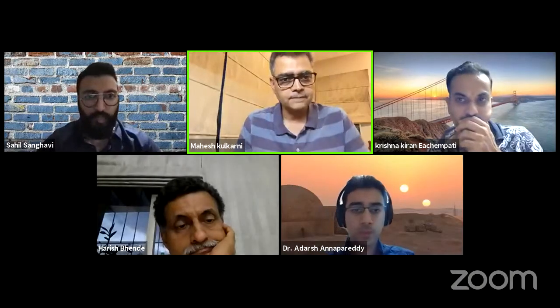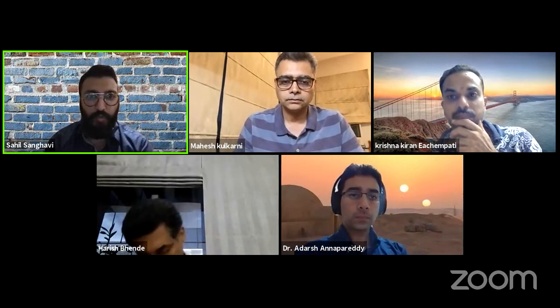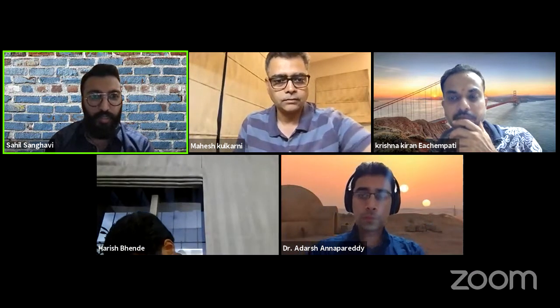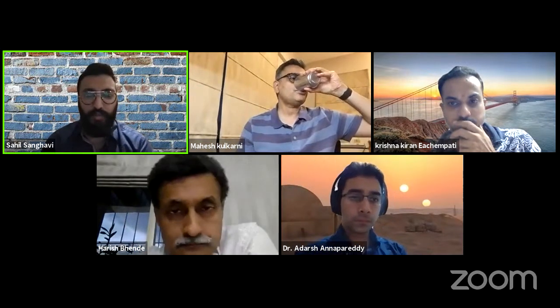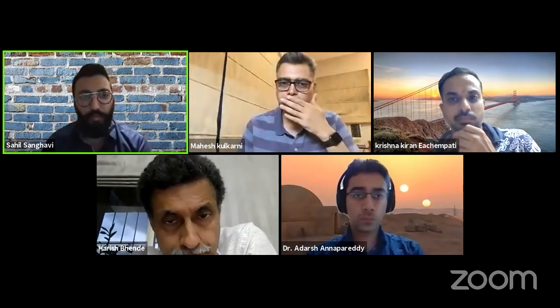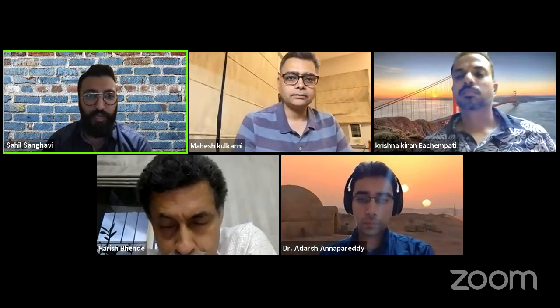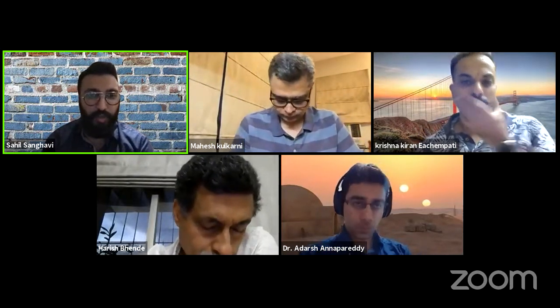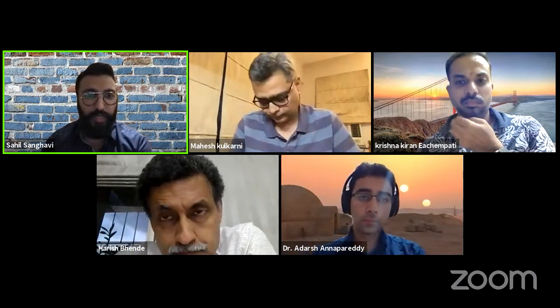Thanks, Adarsh. Sahil, do you want to lead the discussion for this one? Yeah, I think as he mentioned, the unparalleled accuracy in component positioning is the major advantage, because many times we see our post-operative X-rays with the conventional techniques, and we feel, oh, this cup should have had slightly less inclination, slightly more version, because what we are seeing intra-op is really just eyeballing or a 3D visualization in our minds. But the robotic precision it offers is probably the game changer in my mind.